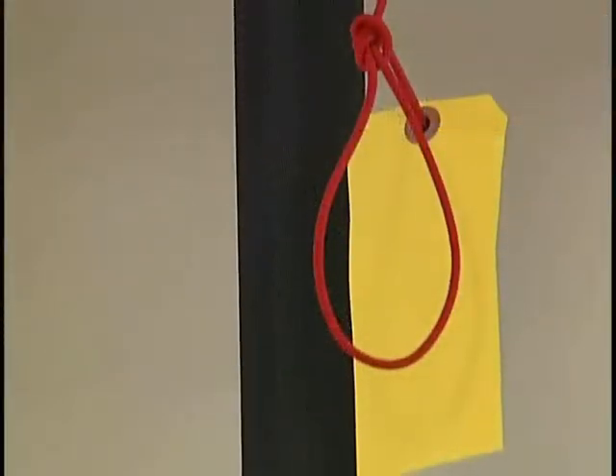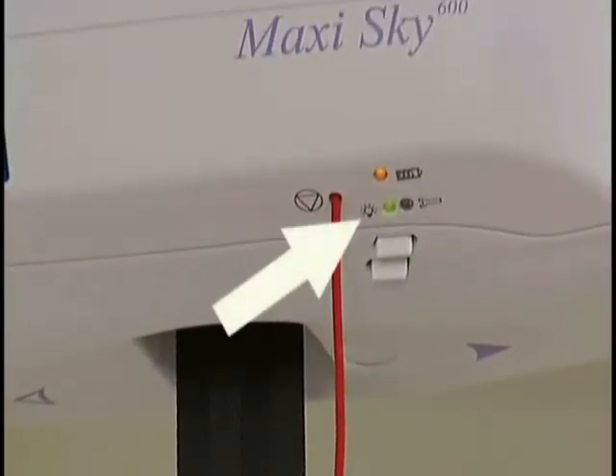If the lift does not work, gently pull on the red cord until you hear a click. The green light should illuminate.